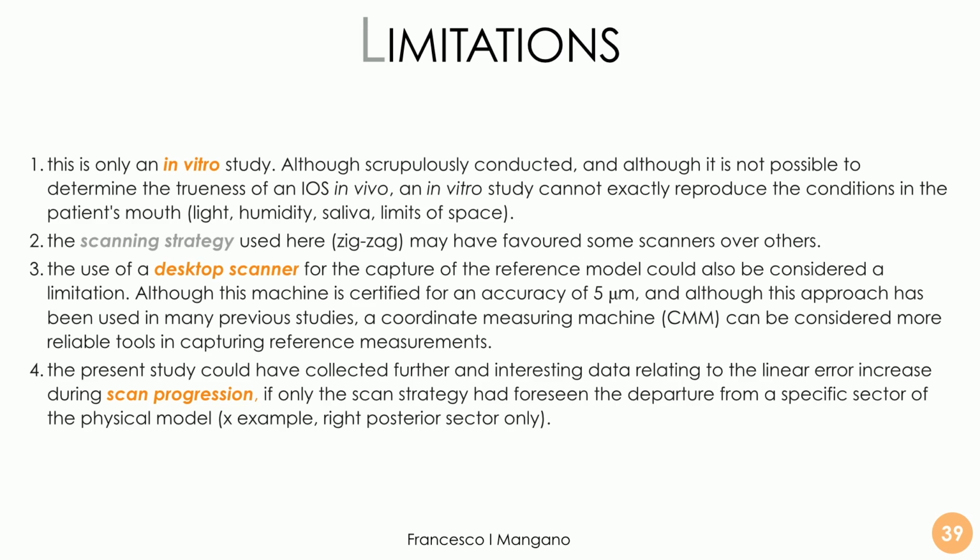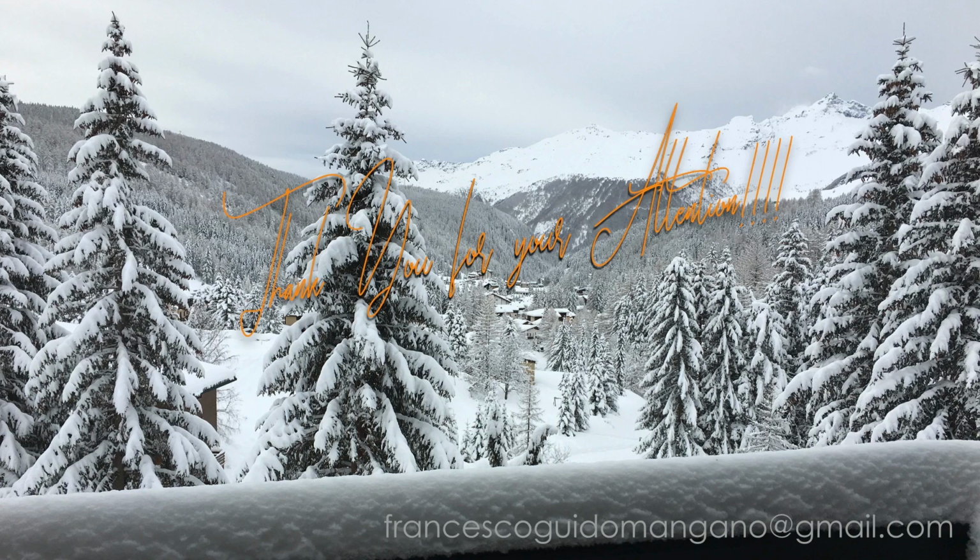So we are talking about a desktop scanner that is very powerful and very similar in terms of result to an industrial optical one. And the other limitation of this study is that we didn't start from the same scan body in all the scans. So we couldn't evaluate perfectly the scan progression, but it's a limitation of this study, and we will try to overcome this limitation with the next studies.